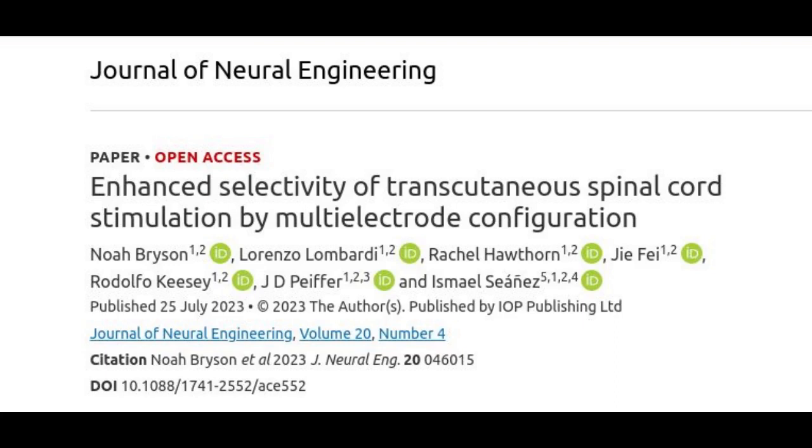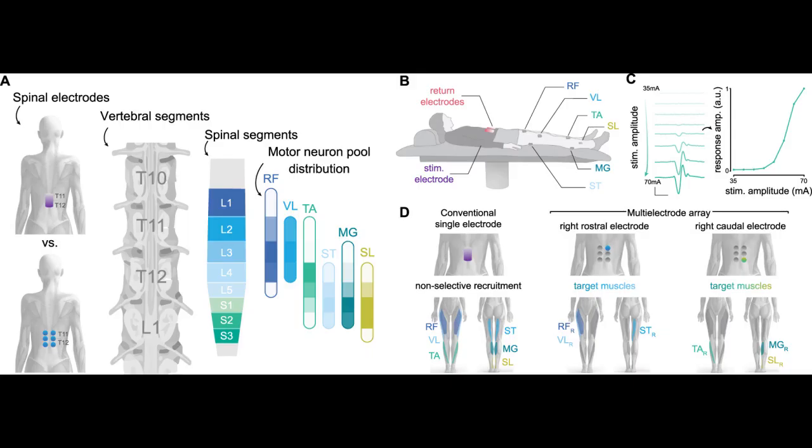One kind of stimulation, called epidural spinal cord stimulation (ESCS), implants electrodes underneath the skin near the spine and sends electrical signals to stimulate specific muscle groups. In a spinal cord injury, neuronal communication from the brain to muscles in the body may be interrupted, but the connections from the spinal cord to the muscles themselves remain intact. ESCS can get extremely close to the spine and essentially allow the weakened signals from the brain to reach their targets in the spinal cord to reactivate the muscles.